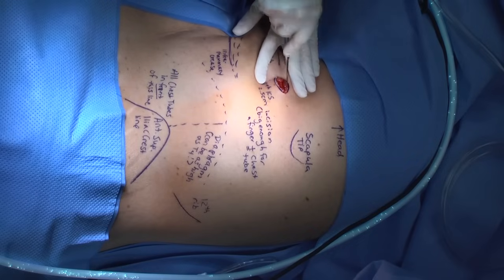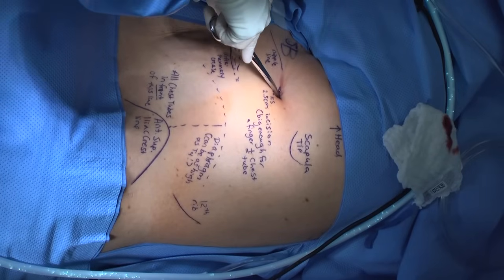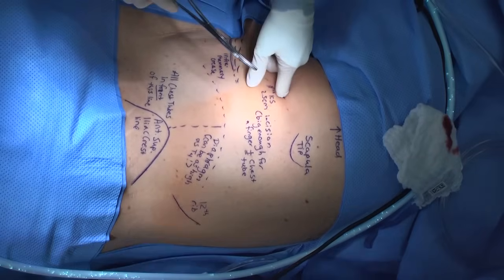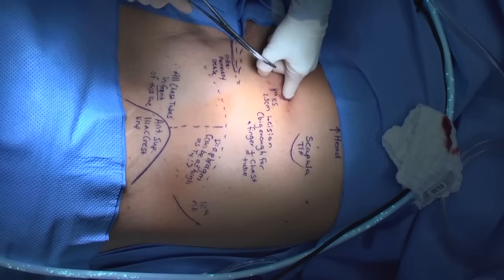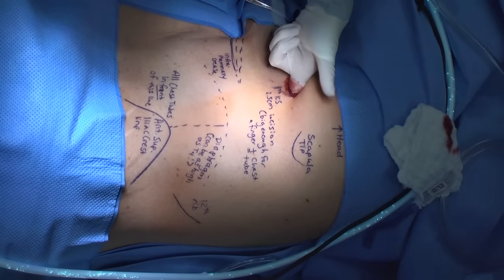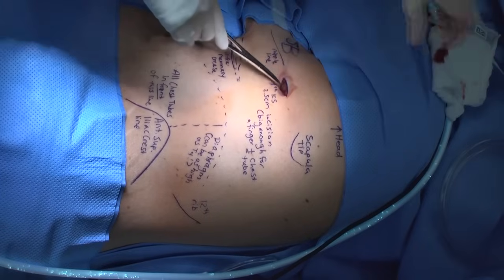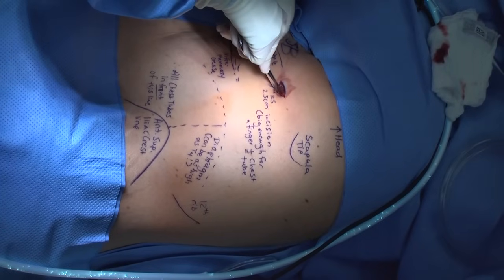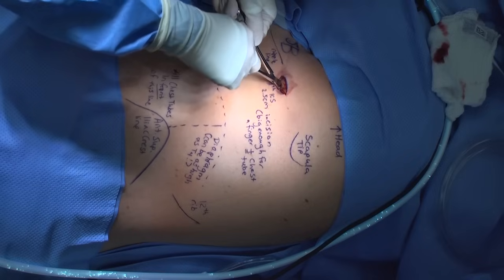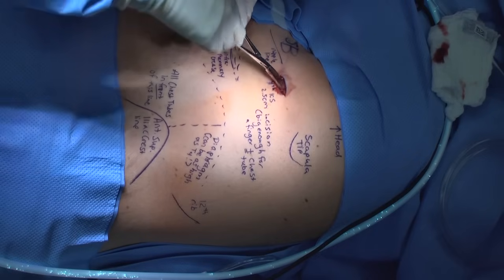Our incision is created. Blunt dissection is carried down to the chest wall. A finger can be used to help identify the top part of the rib. Remember that the intercostal artery, vein, and nerve run along the underside of the rib, and injury to these vessels can result in significant bleeding. The chest should be entered bluntly with a hemostat, curved Kelly clamp, or your finger. Brace your dominant hand with your second hand to avoid advancing the clamp too far into the chest, risking injury to the lung or heart on the left side. Dilate the track starting at the level of the pleura, backing into the muscle, the sub-q, all the way up to the level of the skin.